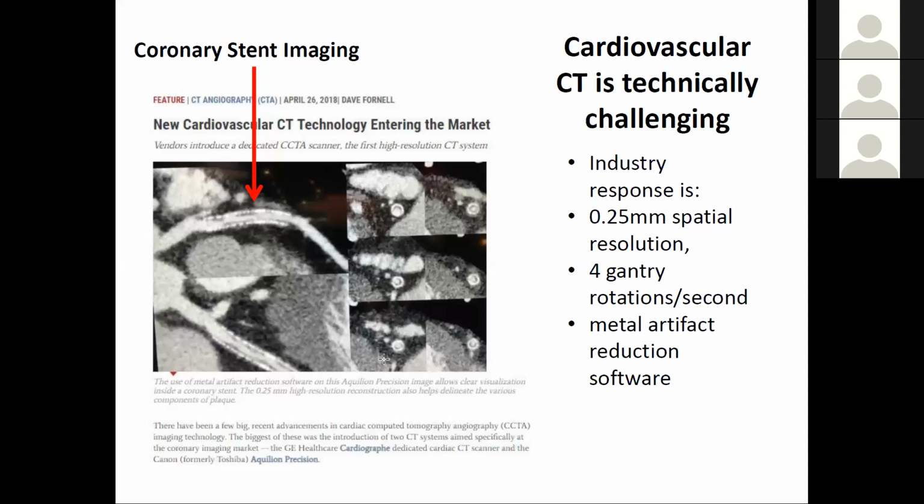If you have a principled reconstruction, you'll still eventually run into photon starvation, but your model base should at least predict that it should be zero. See, the streaks are coming from something like filtered back projection. You've got one of two things. With analytic reconstruction, you're trying to make as if data: what would the sinogram have looked like if there was no metal artifact? Whereas the iterative reconstruction can say, okay, there is metal there, it's supposed to go to zero, and it did that. Fine, we're all set.